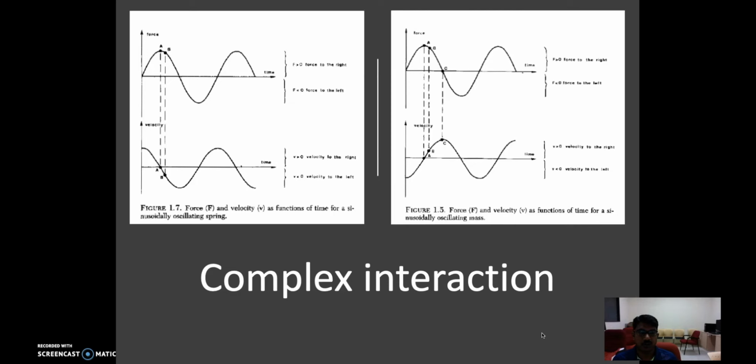So the amplitude reduction without change in phase is considered as resistance, which is because of friction, but the phase change because of the system is considered as reactance.